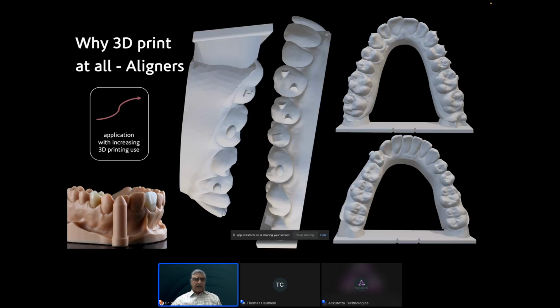Here in India, when I work here in India, we also print orthodontic aligners. And we create these models on orthodontic planning software like Archform or Maestro 3D or whatever it is.